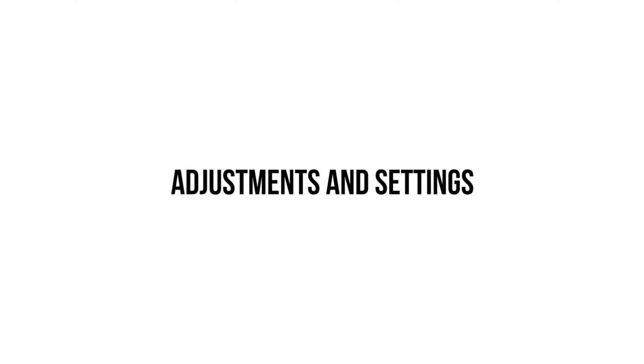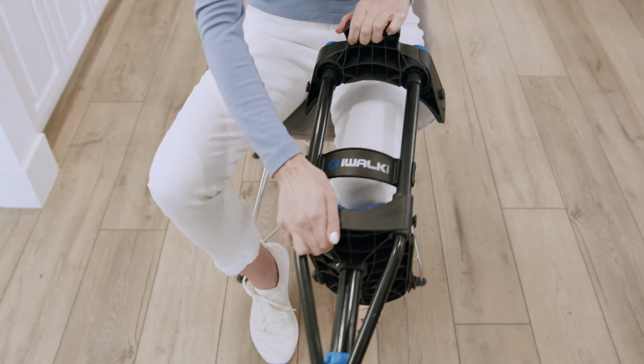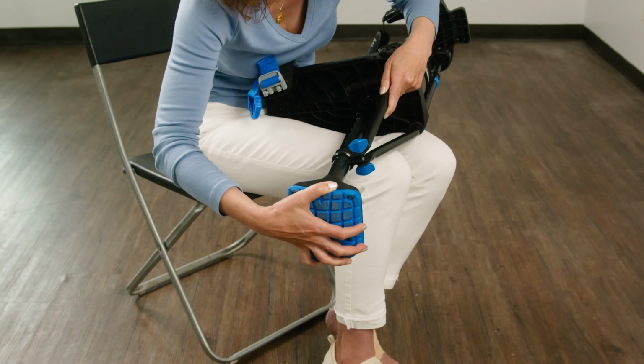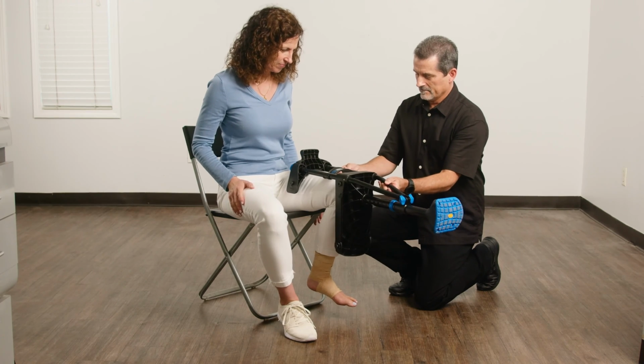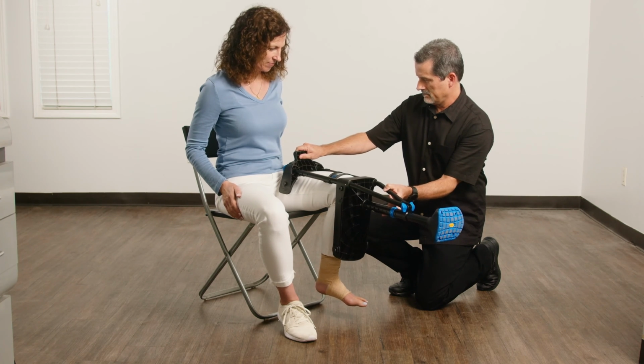Adjustments and settings. Since every human leg is different, the iWALK crutch has a variety of adjustments that will allow you to tailor it to your patient's specific leg size, shape, and alignment. In this section, you will learn how to use these adjustments to properly fit the iWALK crutch to your patient.